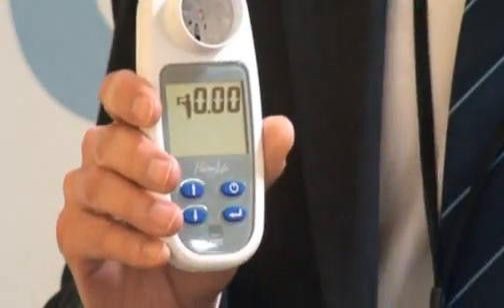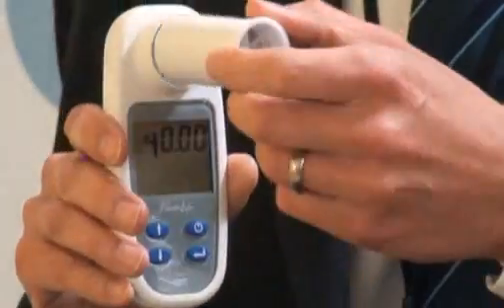The patient is now asked to blow into the spirometer. So I put a mouthpiece in and just do a quick test.